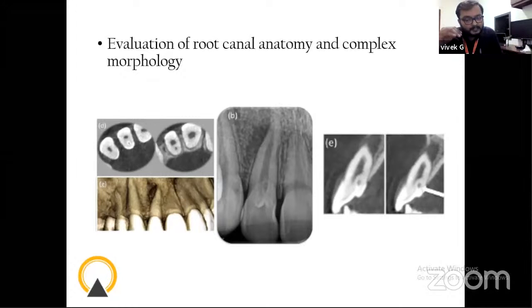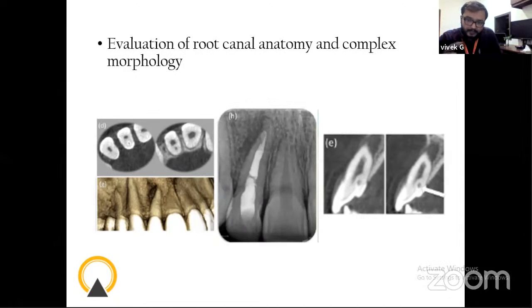So if there is an invagination of enamel into the dentine in the radicular portion, then we call it dens invaginatus, or tooth within a tooth, right? So this is a case of dens invaginatus of the lateral incisor, and that is what is causing this periapical lesion on the tooth. And with the help of this information, the endodontist could well go ahead with the root canal.